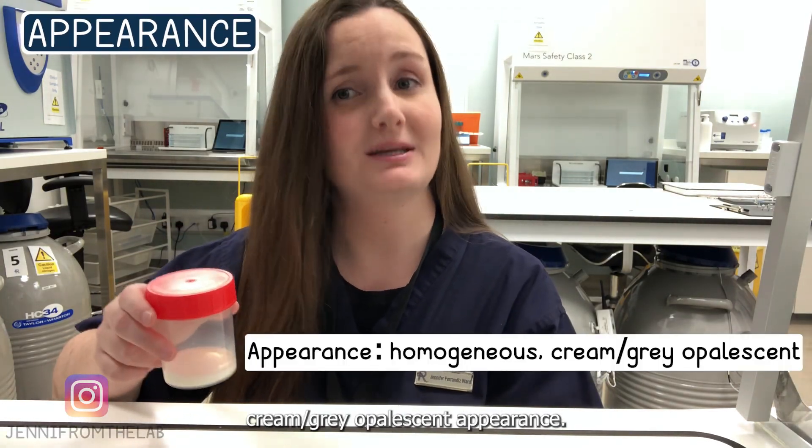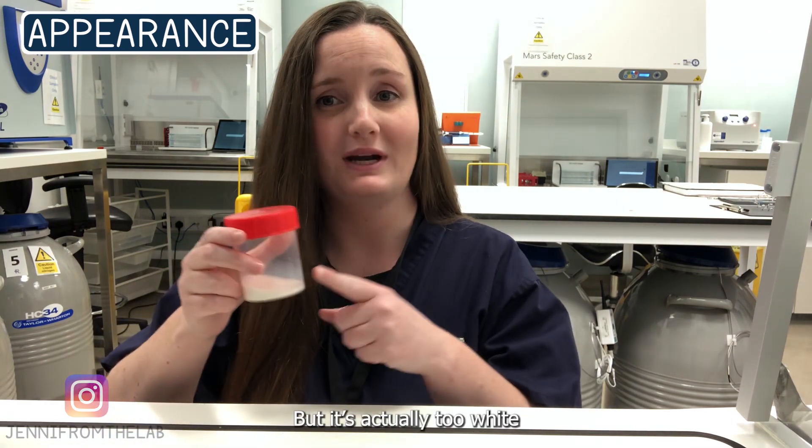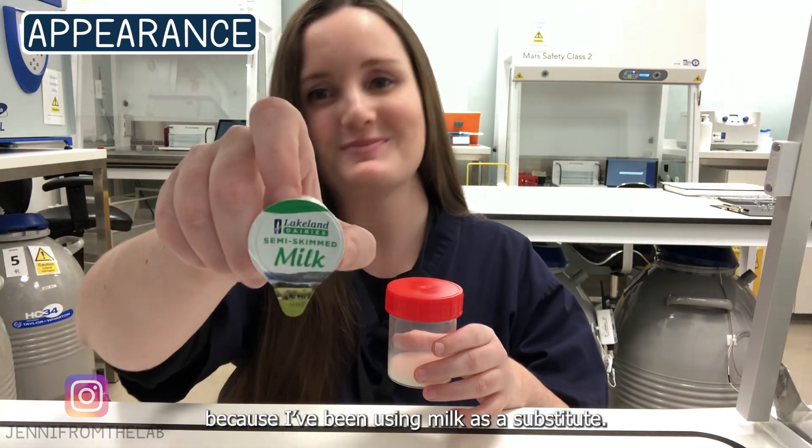Once the sample has liquefied, it should have a homogeneous gray opalescent appearance. It's actually too white here because I've been using milk as a substitute.